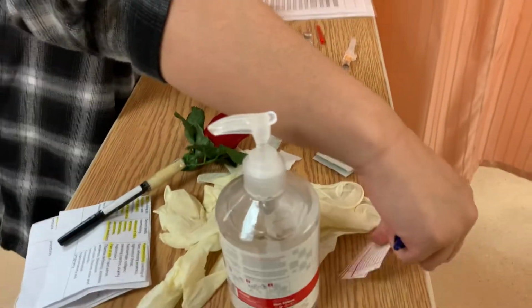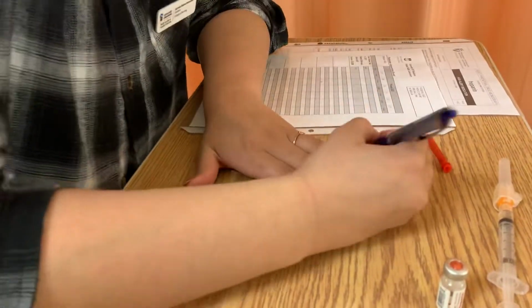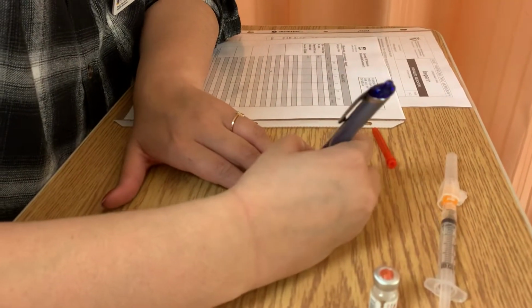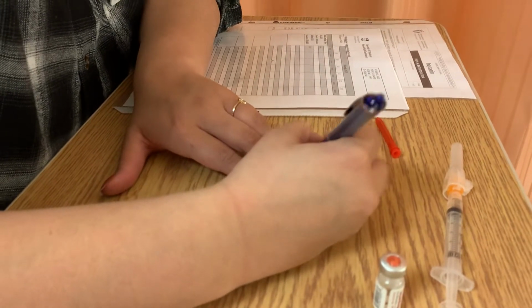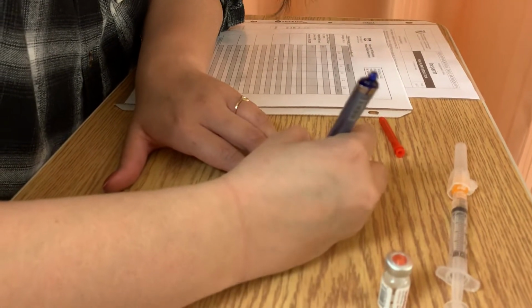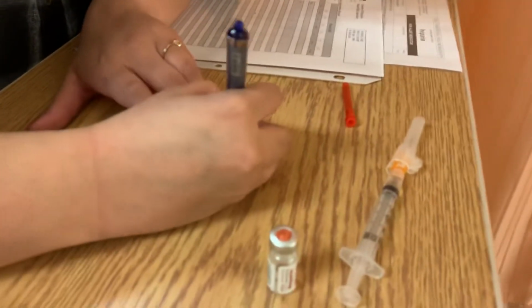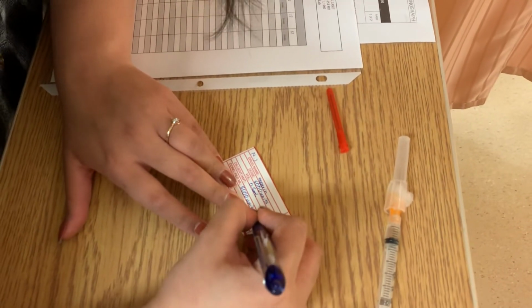So now that I have my medication ready, I will need to make my label immediately. Let's move this aside. Okay. So, patient is Nursing Jake, NJ. Drug name is heparin. Right dose is 5,000 units. Volume is 0.5 ml. Concentration 5,000 units per 0.5 ml.